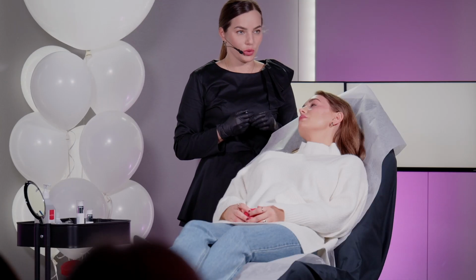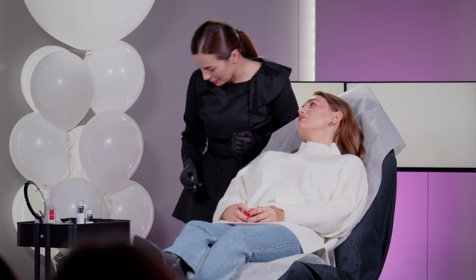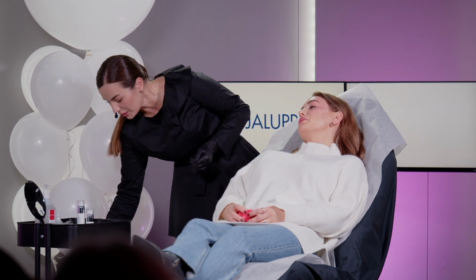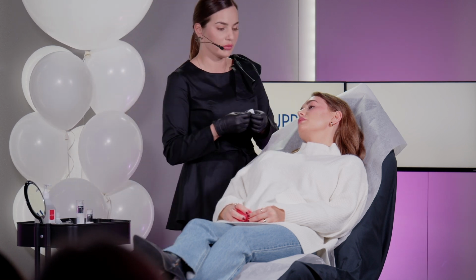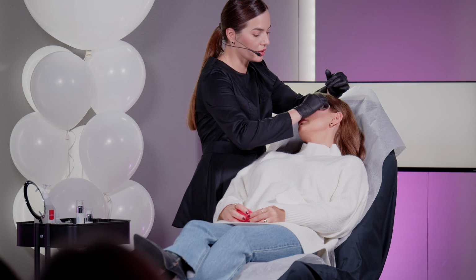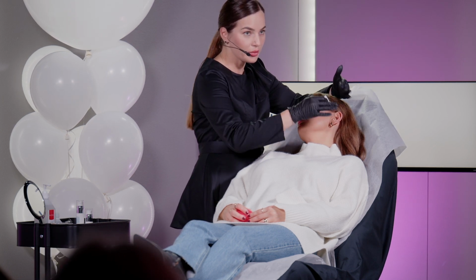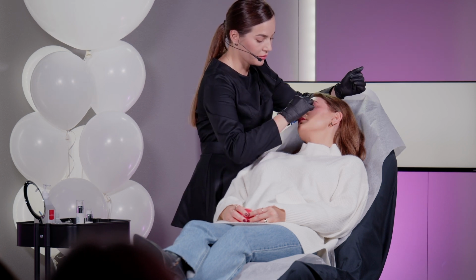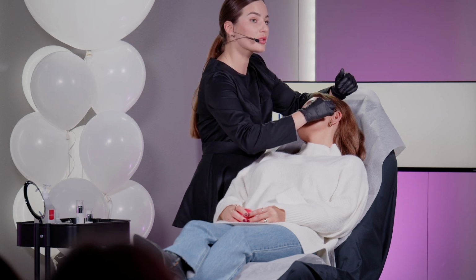I can inject Botox in the same session with Young Eye. First I inject Botox, then I inject Young Eye. Because you need to apply numbing cream, and I do not inject Botox with numbing, so first will be Botox, then Young Eye. But this is not a Jalupro protocol, so never mix botulinum toxin together with Young Eye, only with Classic. And if you want to inject Botox, this is just separately. First Botox, then Young Eye.